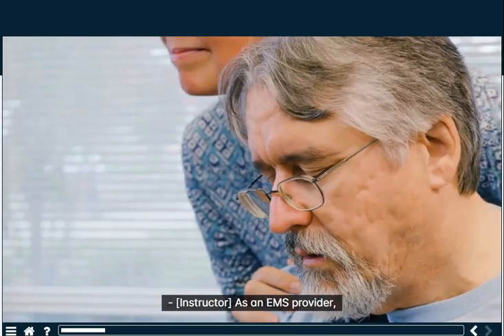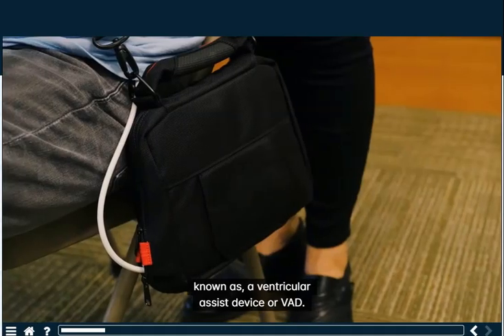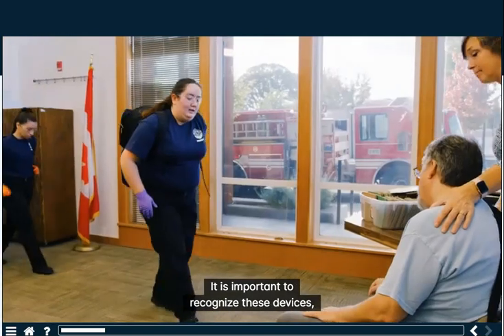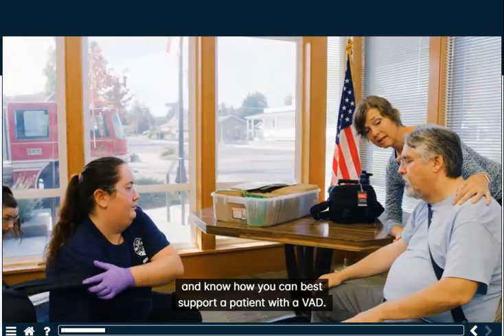As an EMS provider, you will likely encounter a patient who has an implanted mechanical support known as a ventricular assist device, or VAD. It is important to recognize these devices, understand their purpose, and know how you can best support a patient with a VAD.